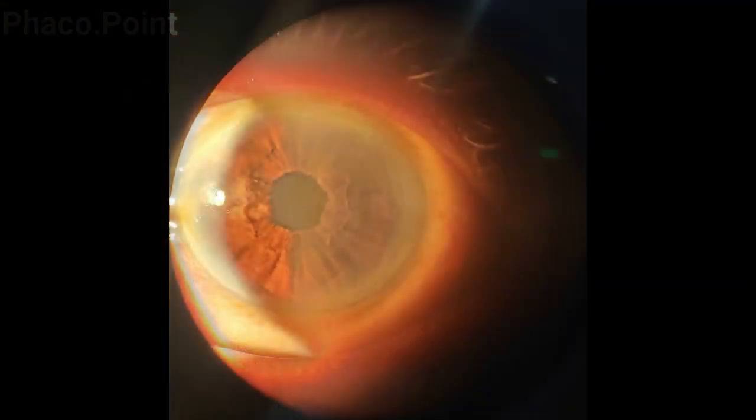Now let's see what the patient looked like on day one post-operatively. We have a pupil that has come down to about two and a half to three millimeters in size. You can still see the small micro tears in the pupil, but the patient was very comfortable and very satisfied. Thank you, and I hope this was a useful demonstration of how to manage a small pupil and the technique of stretch pupilloplasty with Y-shaped hooks.